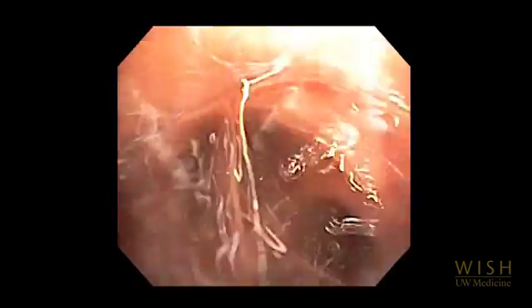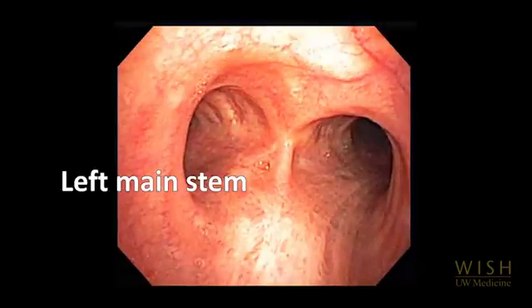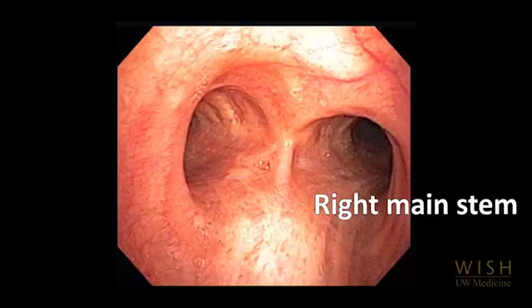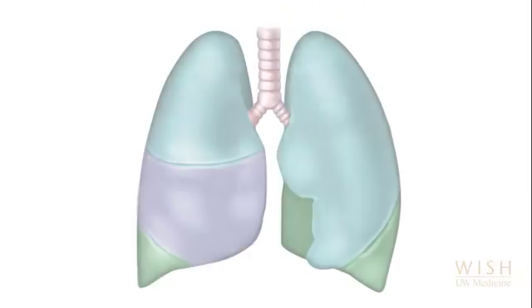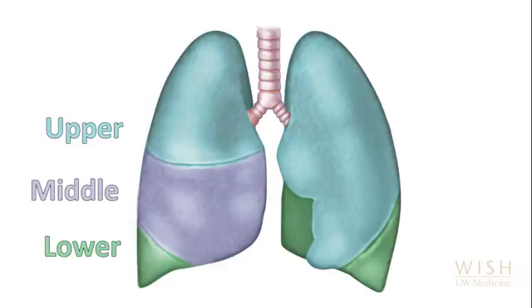Lidocaine is administered at the main carina prior to advancing into the main stem bronchi. The main carina should be sharp. The left main stem typically branches off at a slightly more acute angle than the right main stem. The right lung has three lobes — upper, middle and lower. The left has only two — upper and lower.